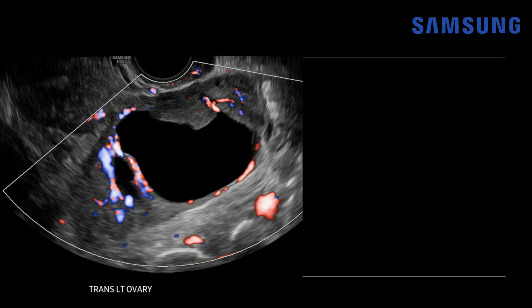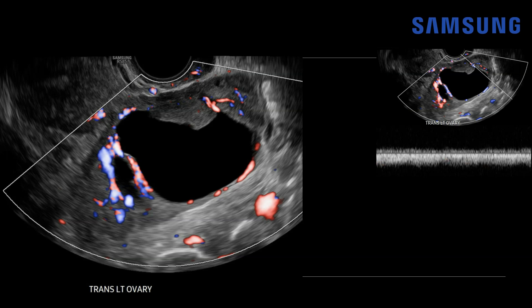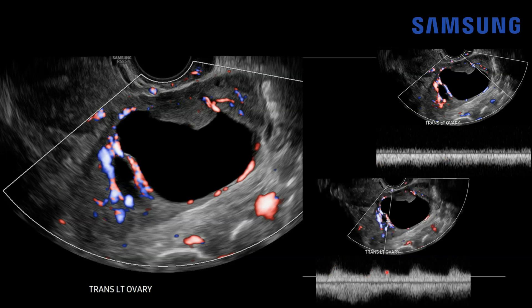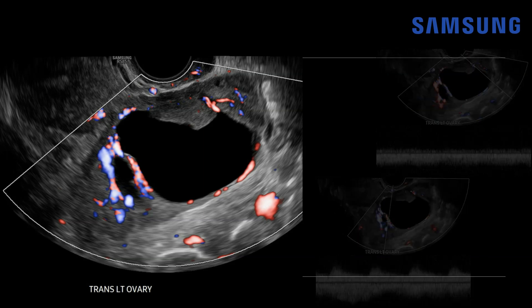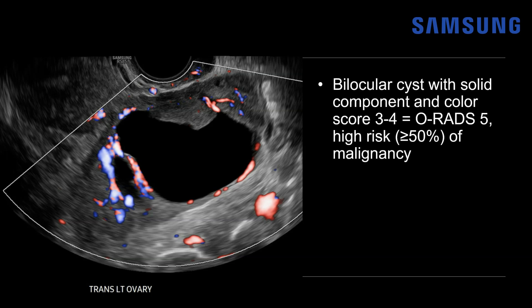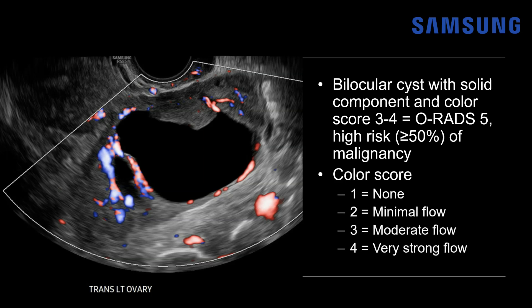Confirming with spectral Doppler, we notice a venous waveform and also a low-resistance arterial waveform — systolic and diastolic — confirming blood flow. Using ORADS to stratify: this is a bilocular cyst with a solid component and a color score of three to four, consistent with ORADS 5, similar to the prior case, with a 50% or more risk of malignancy. The ORADS color score is: no flow = 1, minimal flow = 2, moderate = 3, and very strong = 4, so this lesion demonstrates moderate to very strong flow.